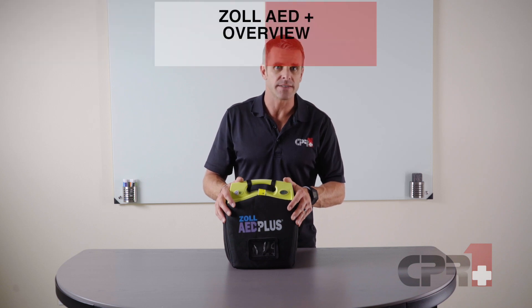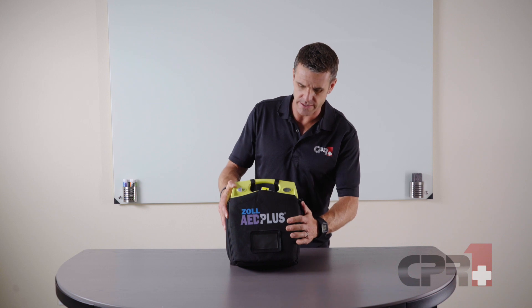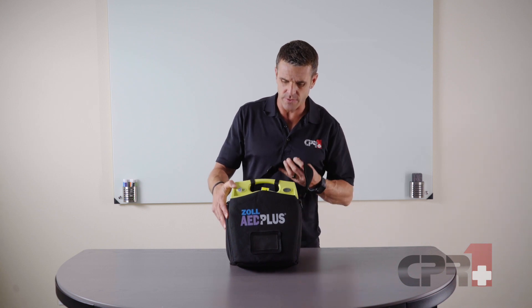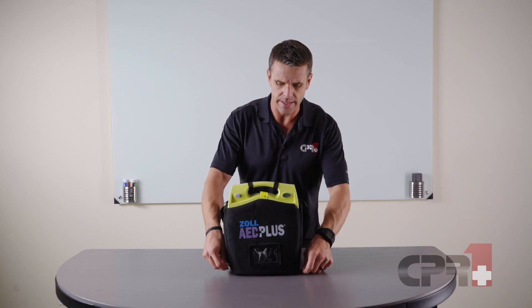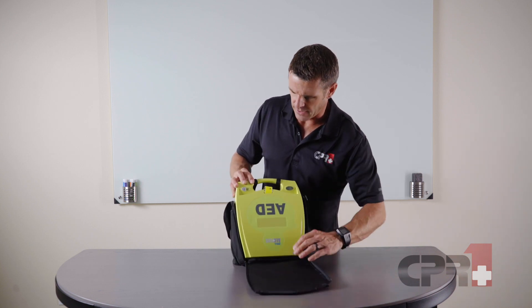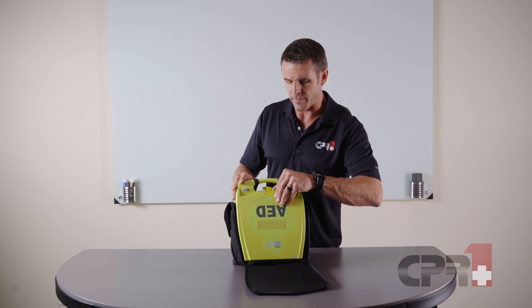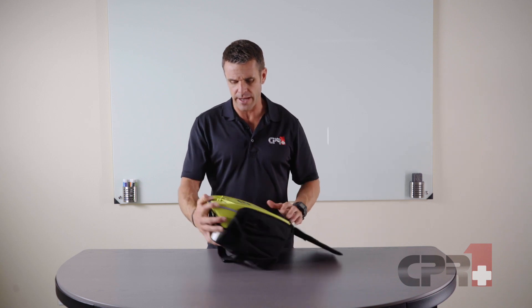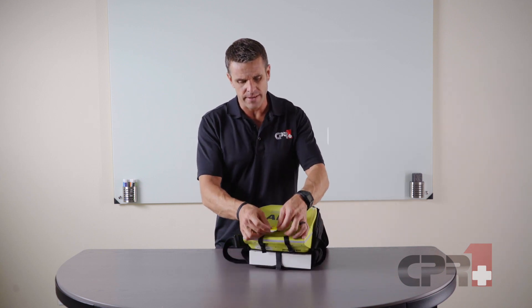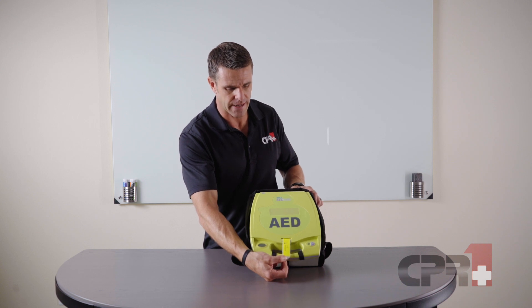This is the Zoll AED Plus. One of its features is a rugged exterior case. To use the AED, we unzip the case, press the on button, and pop the unit open. It's also helpful that a tag sticks out giving us the expiration date of the pads inside.